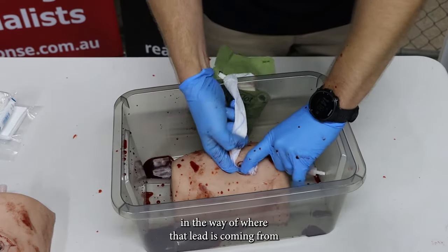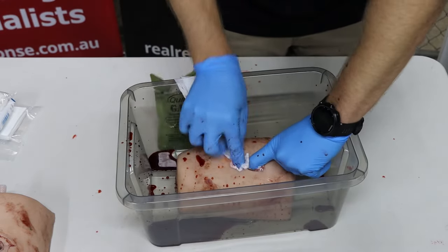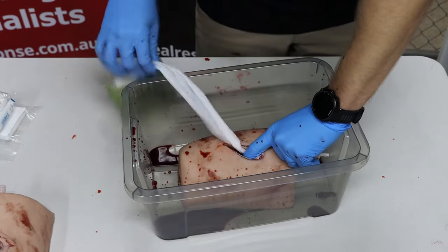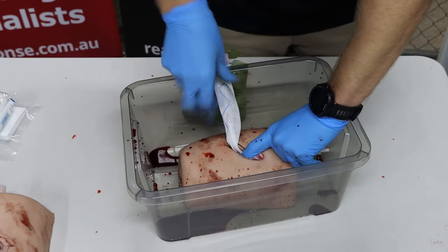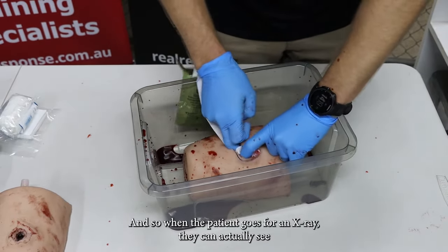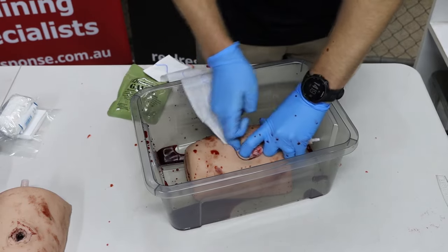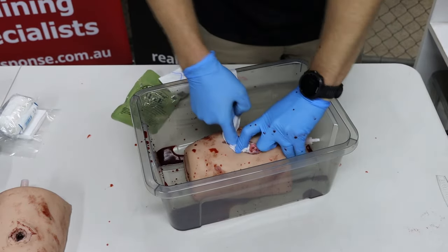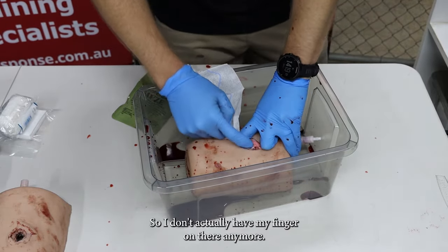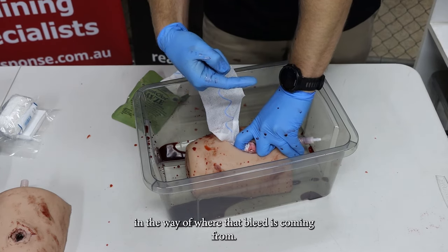Keep pressure directed in the way of where that bleed is coming from. That little blue strip you can see — when the patient goes for an x-ray, they can actually see it because it's a radiopaque line showing where the gauze is in there. That clot is going to start to form where that bleed is coming from. Even though I don't have my finger directly on there anymore, when replacing my finger with the gauze, the pressure is directed toward where that bleed is coming from.